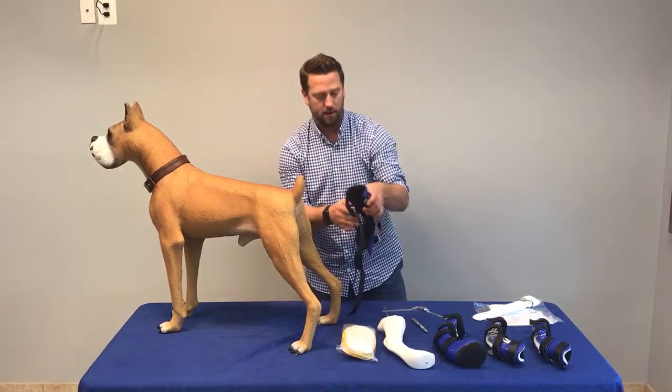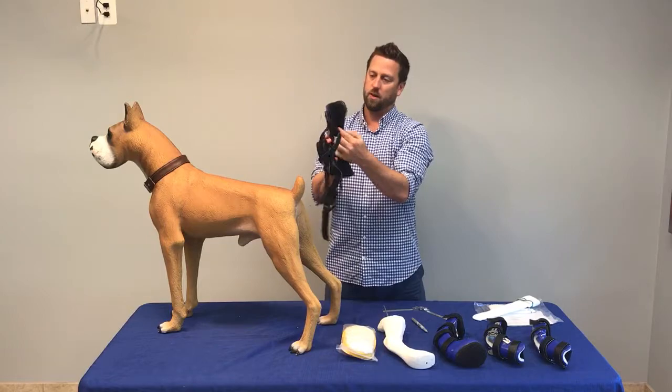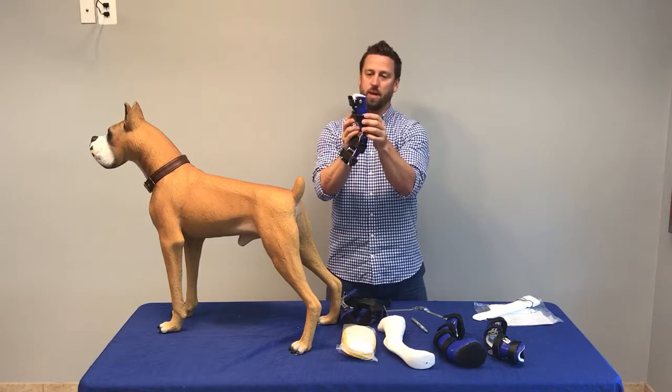We send a new replacement liner with this system. If the liner ever gets dirty, we can send you a new replacement liner, and we can also send it with a non-removable liner system — you'd have to send the brace back for that instance.